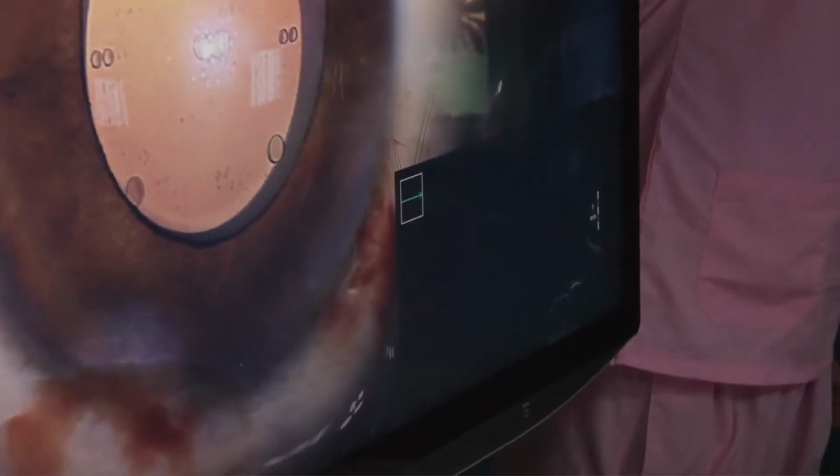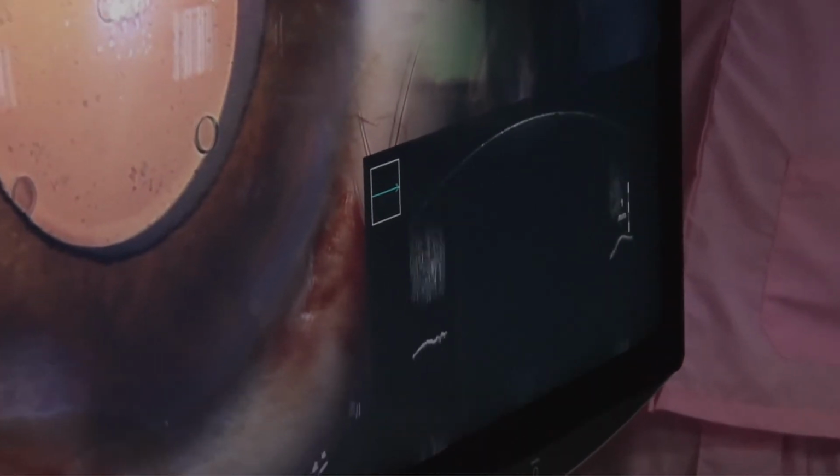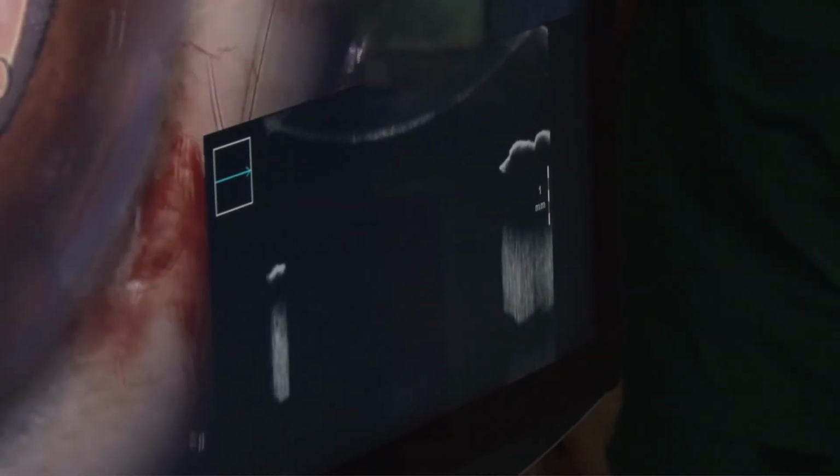So they're trying to get an OCT. It comes on the high magnification one. The vault won't come in low. Okay, so now you can see it on the right side. Can you see the OCT screen? This is visible better now. You can see the iris, you can see the ICL, and you can see the lens. On the right side, you'll see there's a bar which is about 1 millimeter. So you can see here that the vault right now is just less than 1 millimeter.